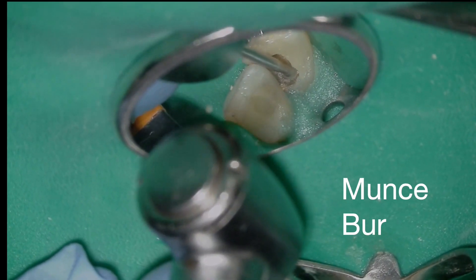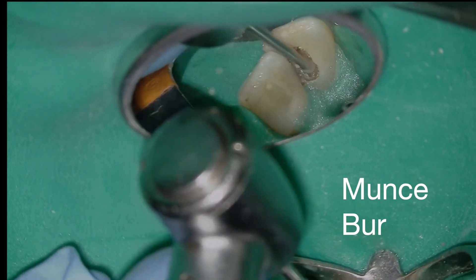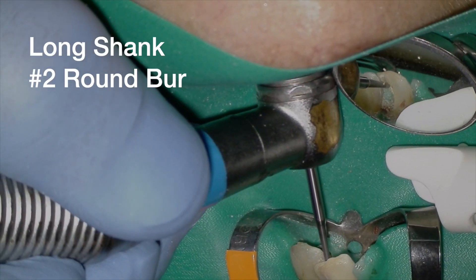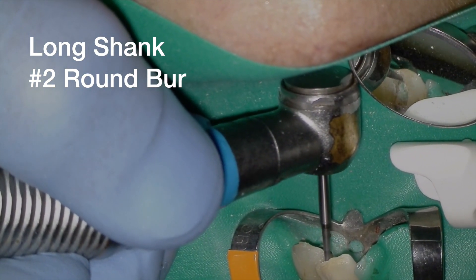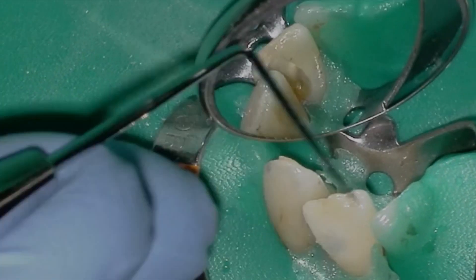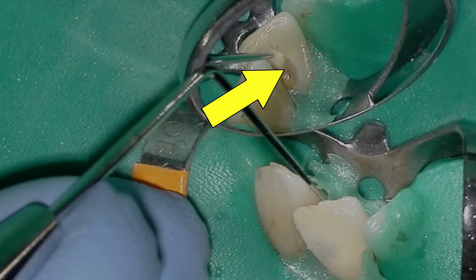After placing the rubber dam, I'm going to use Opal Dam. Now what I'm using is a Munce burr — a long shank slow round burr to remove the decay — and then I'll finish this enamel corner with a number two surgical length round burr. All the decay is gone and now you can see where the pulp chamber is.